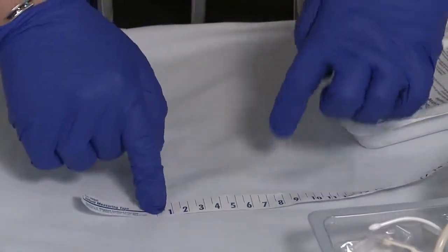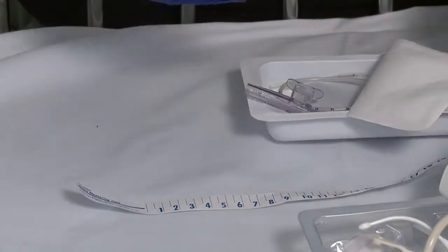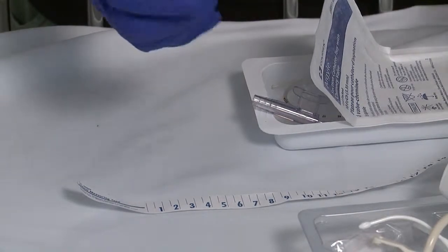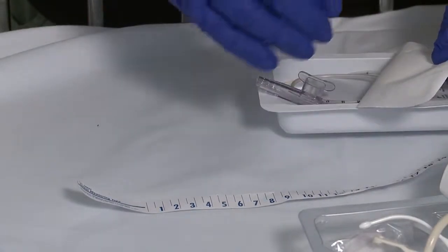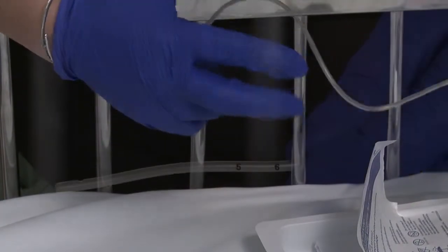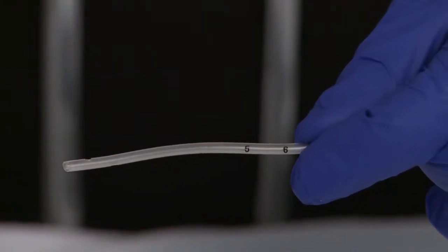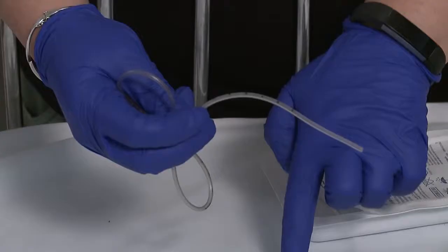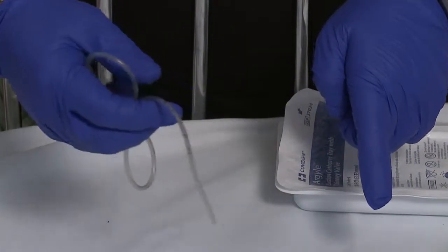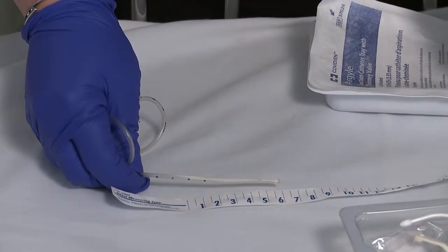You would then mark your centimeters where that safe suction depth is and have this close by whenever you're going to suction. This is considered a sterile procedure in the hospital, but at home it's important that you wash your hands and then have gloves on for any dealings with your tracheostomy. Some catheters are numbered and would correlate to that measurement, so you would know to go to 6 centimeters because that's what you measured. If your sterile catheter does not have measurements, you can simply hold it near that measuring tape and see where you should be suctioning to.